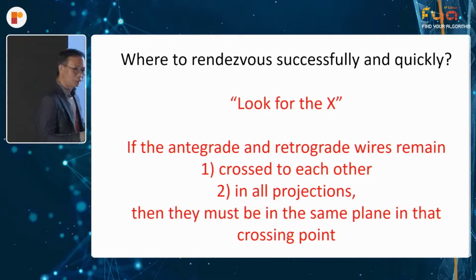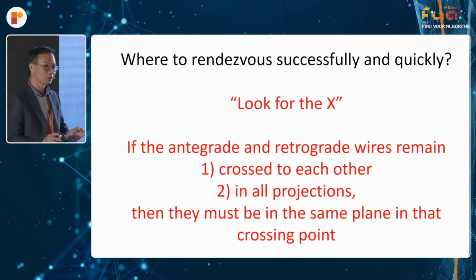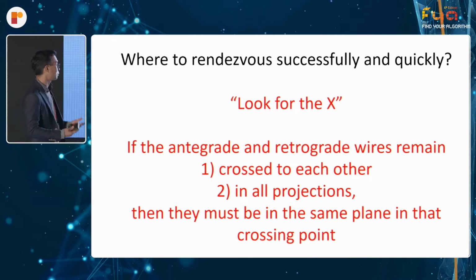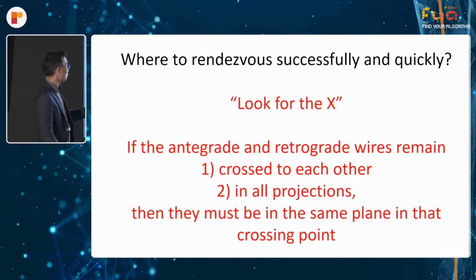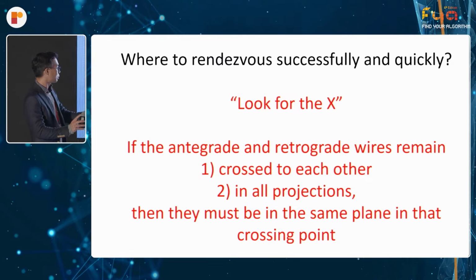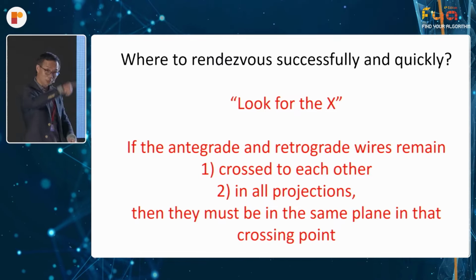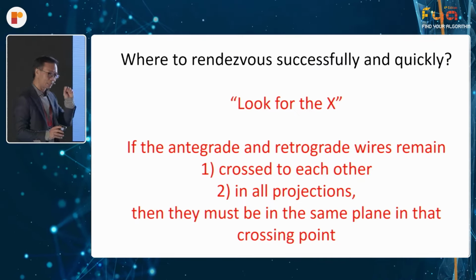Okay, next thing is, you're spending a lot of time crossing, puncturing and everything. You really want to minimize your time to find the exact rendezvous spot. And for me, this is how I teach my fellows. I ask them to look for the X spot. So the principle is this: if the antegrade and the retrograde wires remain crossing each other in all projections, then they must be in the same plane at that crossing point.